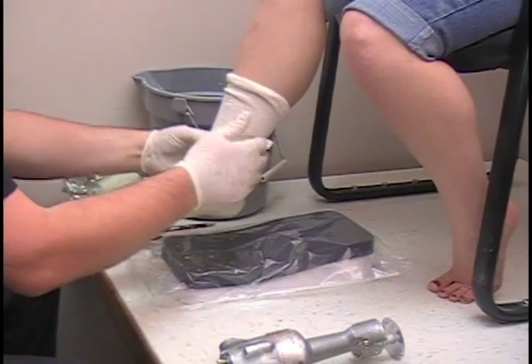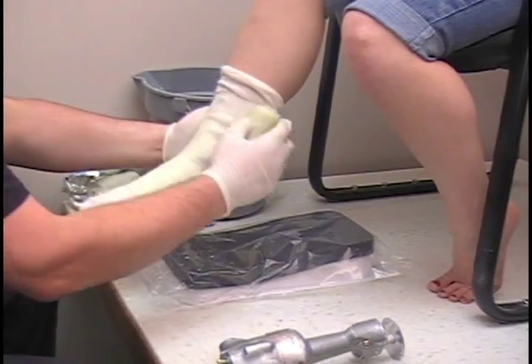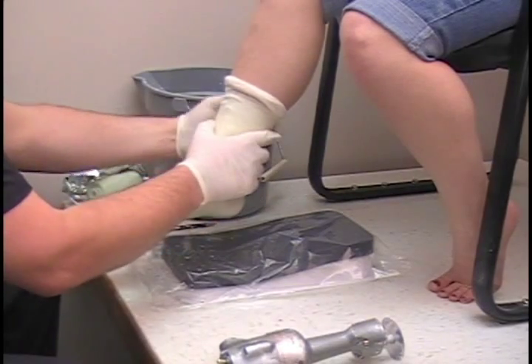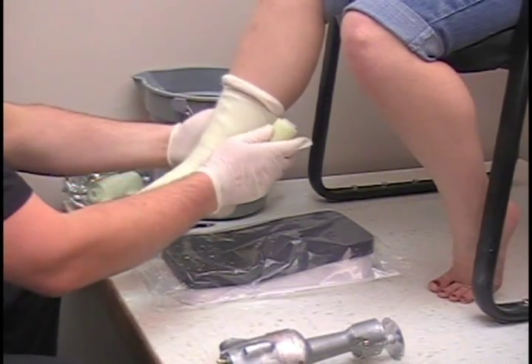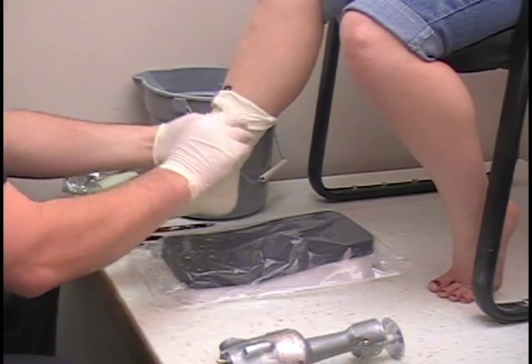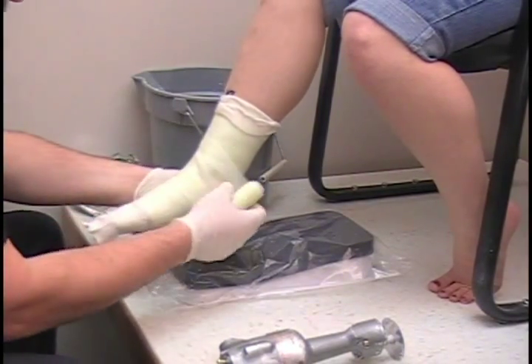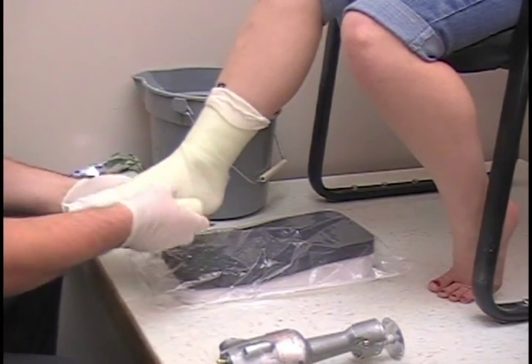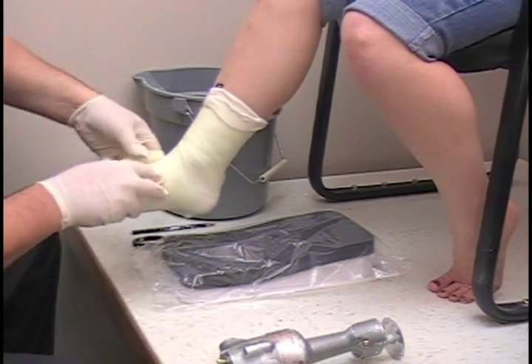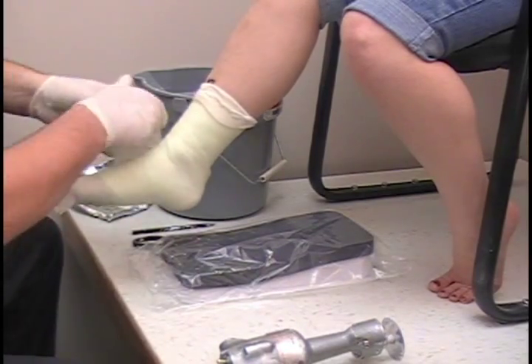Once you get the heel encapsulated, just start it up the leg. Double wrap at the top, and then head back down. For this one, we only needed one roll, and that's going to be just fine.